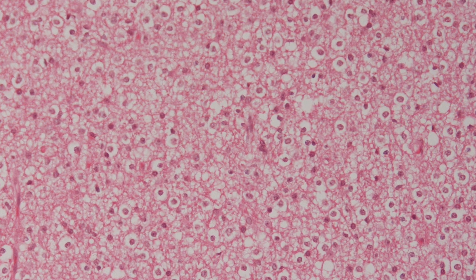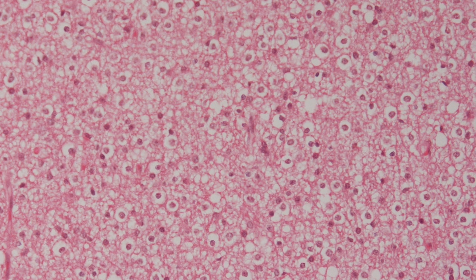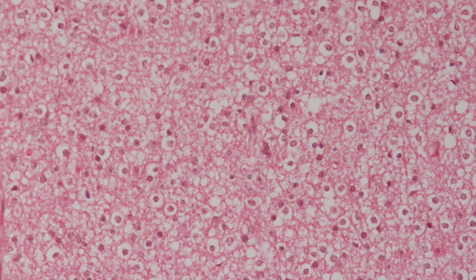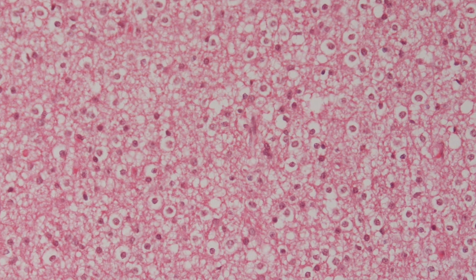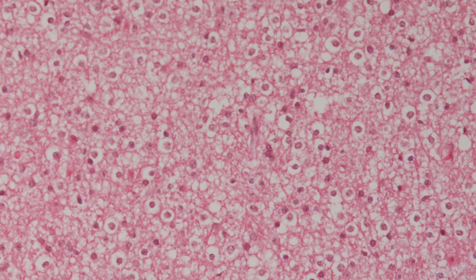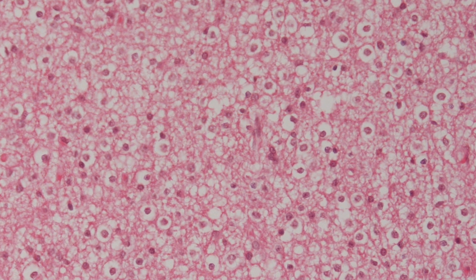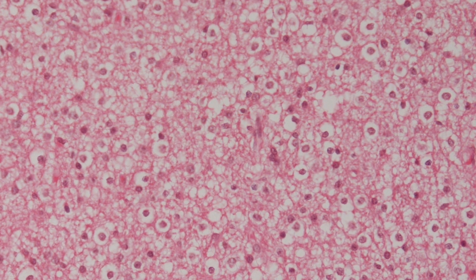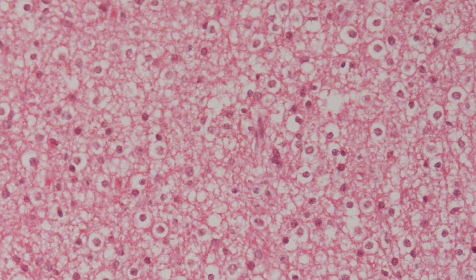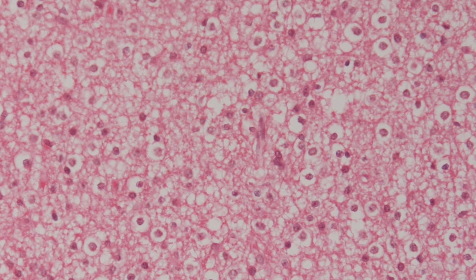Another useful feature for diagnosing oligodendroglioma is the presence of microcalcification. In this particular case, unfortunately there is no microcalcification whatsoever, but you can just about make out a chicken wire pattern of the microvasculature.